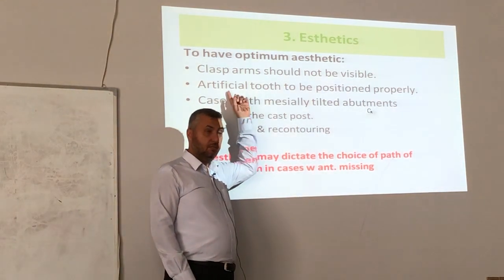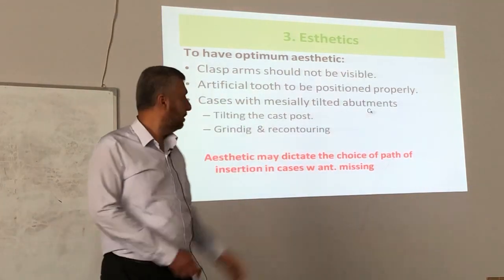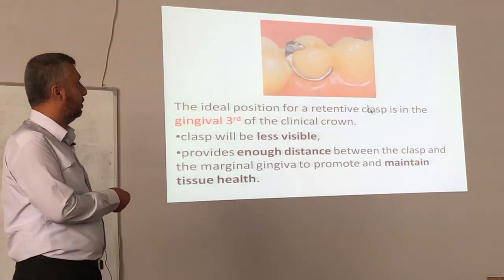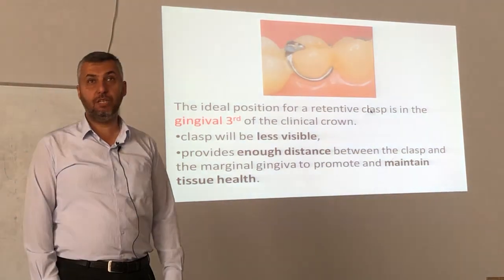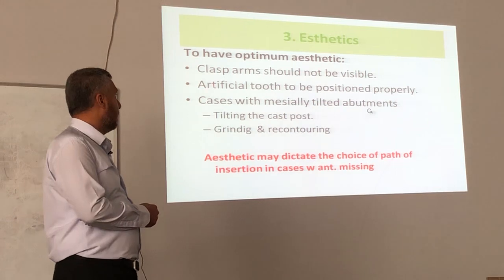If possible, first point, the metal or the clasp, this one, should not appear or be noticed from the patient's mouth.